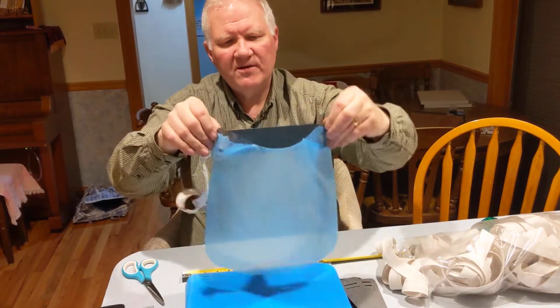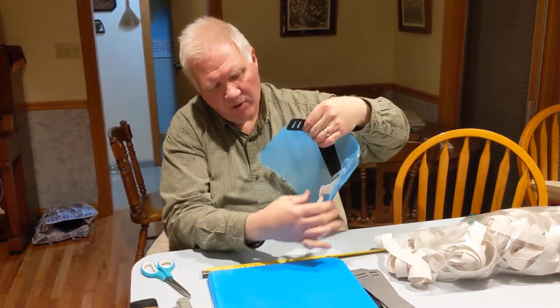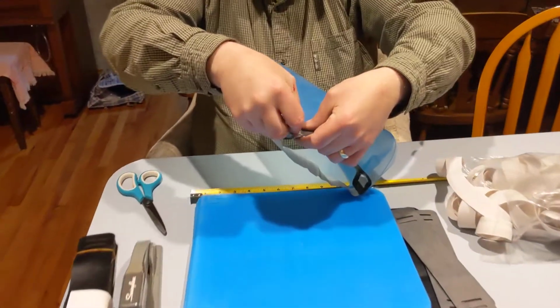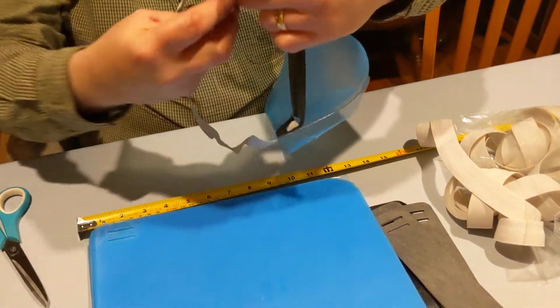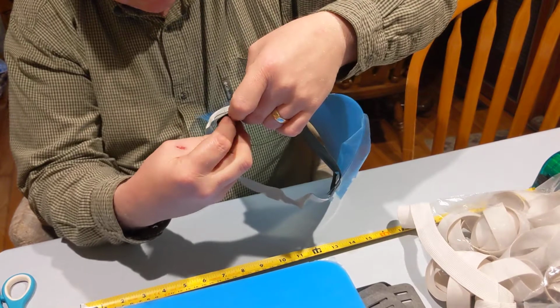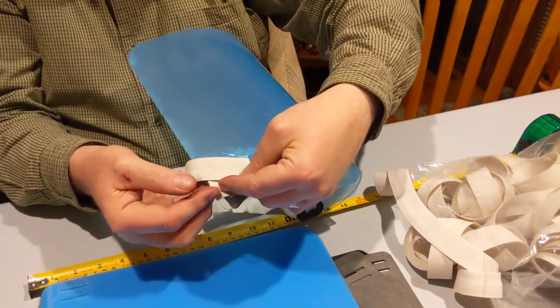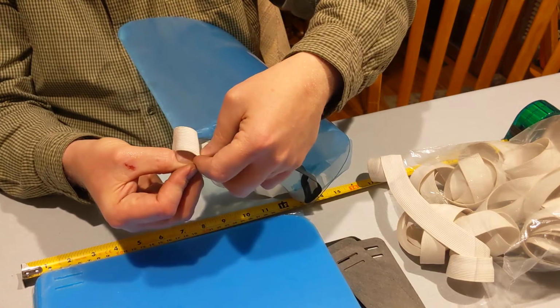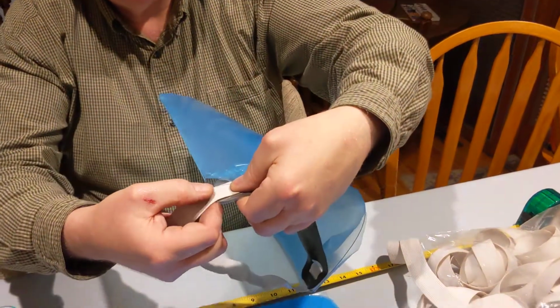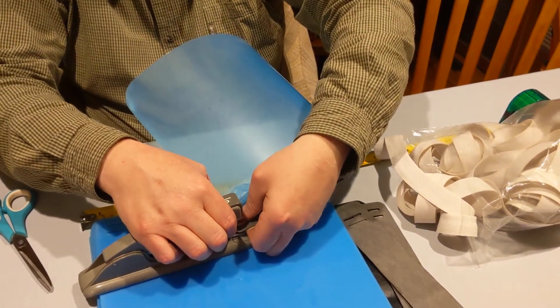So to assemble this, hold it together like this, then peel the plastic back, the protective blue film that is, bring the elastic, be sure it's kept flat, and come through the second slot and through the Naugahyde vinyl. Bring it back through the first slot, through both surfaces, and bring the elastic just to the edge of the PETG plastic. Then don't stretch the elastic, but just bring it taut like this, and then staple again. You'll get used to putting the stapler in with the elastic there.